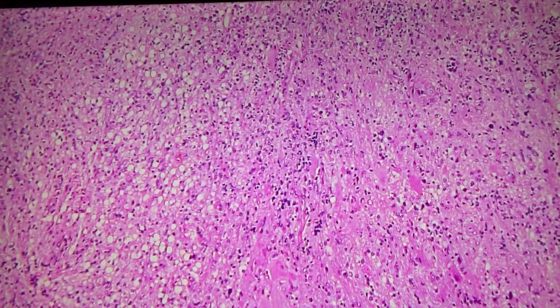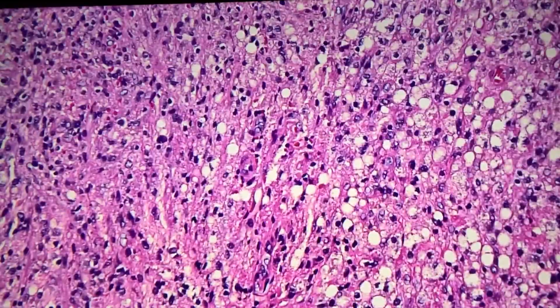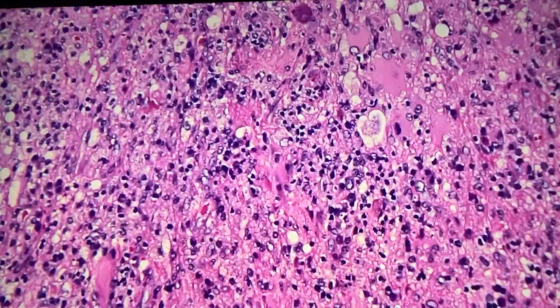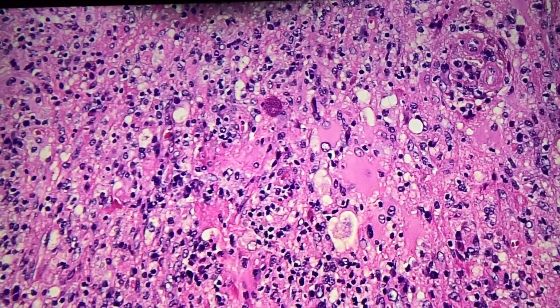So we're dealing with all this inflammation and necrosis, and here are the famous black dots. Go up a little. Up a little. Wow, we almost dotted right over the thing. This is a cytology dot. Cytology dotting skills. Okay, Aaron, here's your board question.